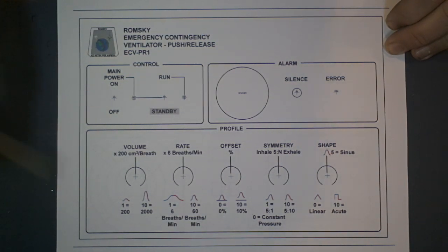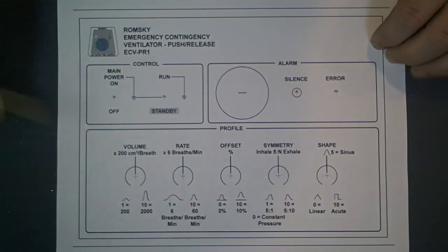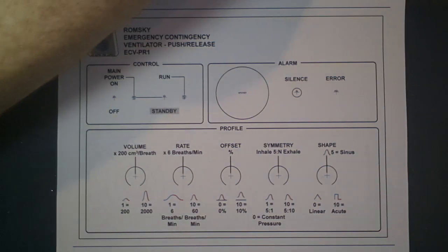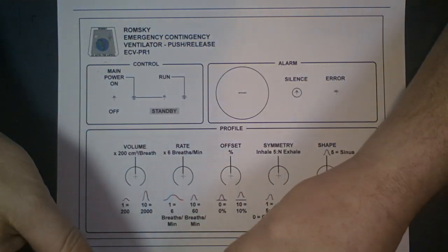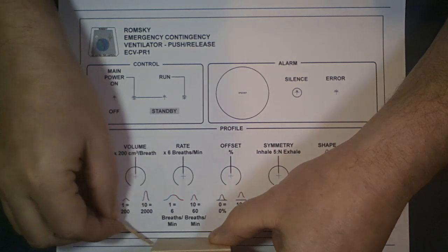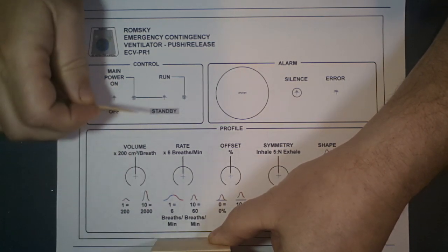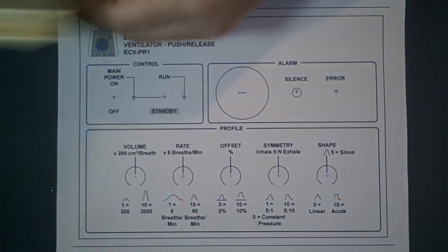You don't see them all here, but I know to cut this same difference around the edge. And that's going to fit into the slot. So if you do the slot right, I should have showed you that. This is a little wider than normal. But when it goes into the slot, if this is the edge of the board where you cut it, this black line should just show on the front surface of your wood. Of course, the notch would be closer to the front, not this far back.